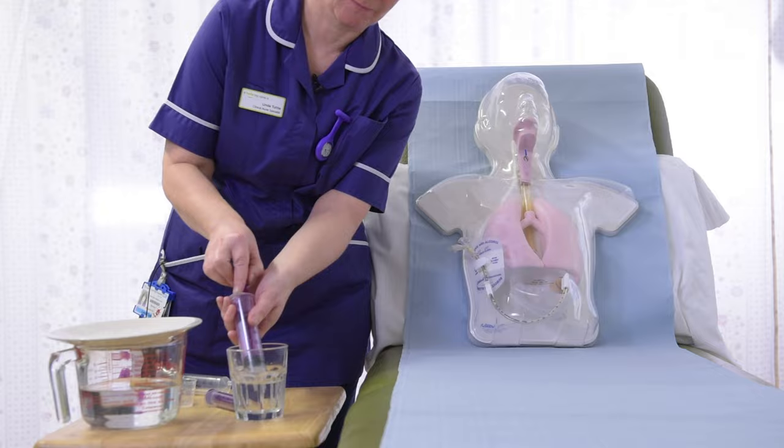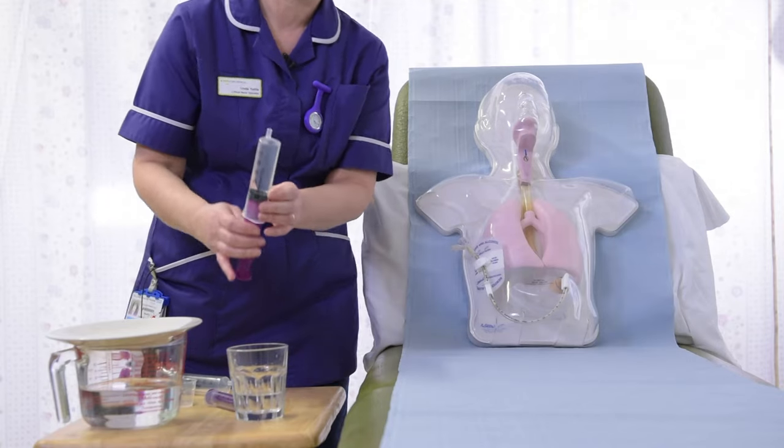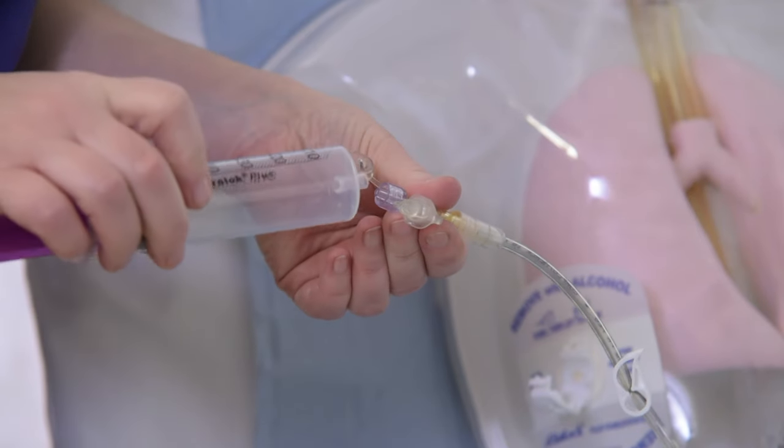Now we will demonstrate how to give a liquid medication. Flush the tube using a 60ml syringe containing the recommended amount of cool, boiled water as advised by your dietitian.